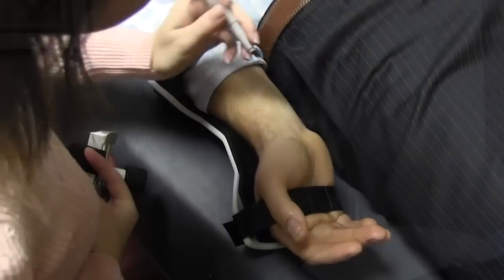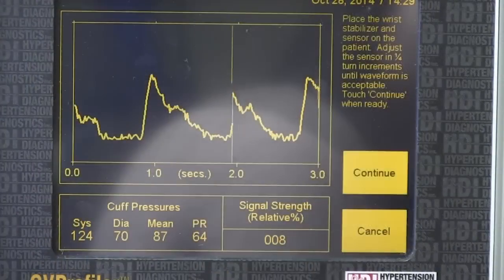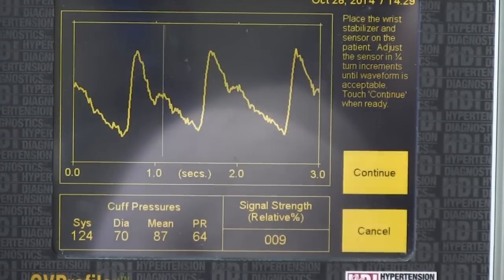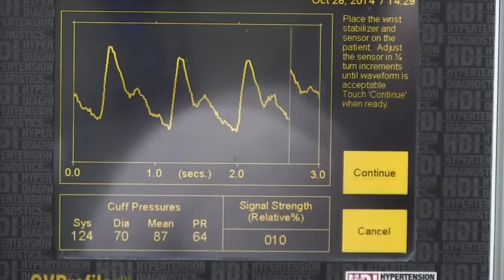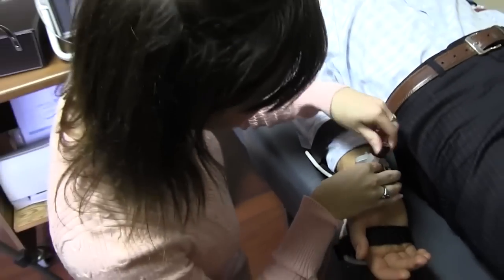Okay. I love it. She's feeling where the pulse is, and she's marking an X on the spot where she felt the pulse with her finger. What she's doing is threading a screw on that to control the pressure force of the sensor diaphragm against the outer skin where the vessel is. With the right amount of pressure, we will get a good reading of the actual acoustical sound of the blood rushing through the radial artery. So that is the acoustic reading, the sound of the blood rushing through the radial artery on the right hand. And we can see this notch right here. The position of that, the slope of the line coming down, and the area underneath the curve here are all part of the calculation involved with determining the arterial elasticity of the small and large arteries.